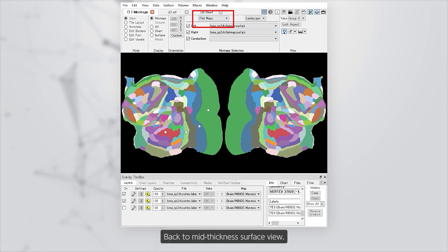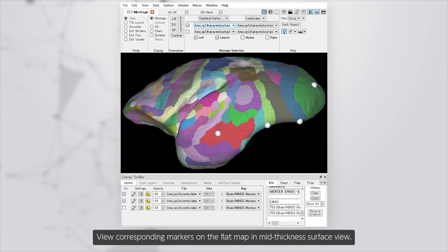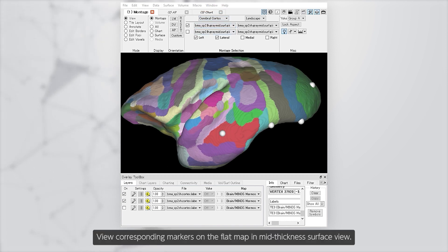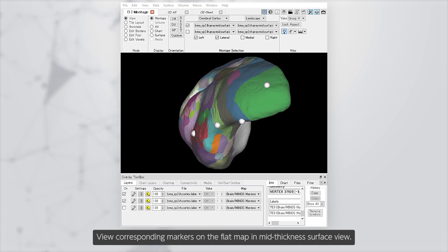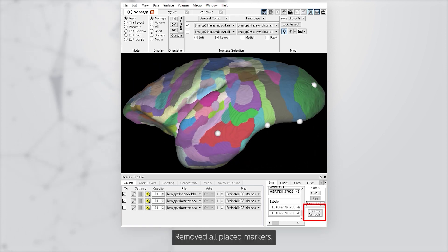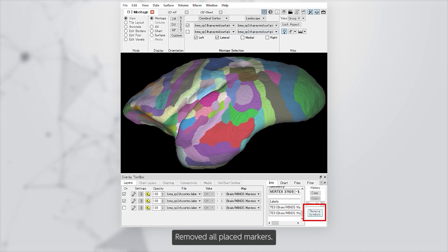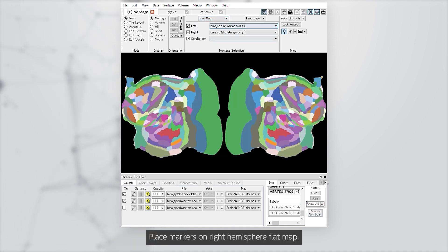Switch back to mid-thickness surface view and view the corresponding markers on the flat map in the mid-thickness surface view. Remove all placed markers, then go back to flat map view and place markers on the right hemisphere flat map.